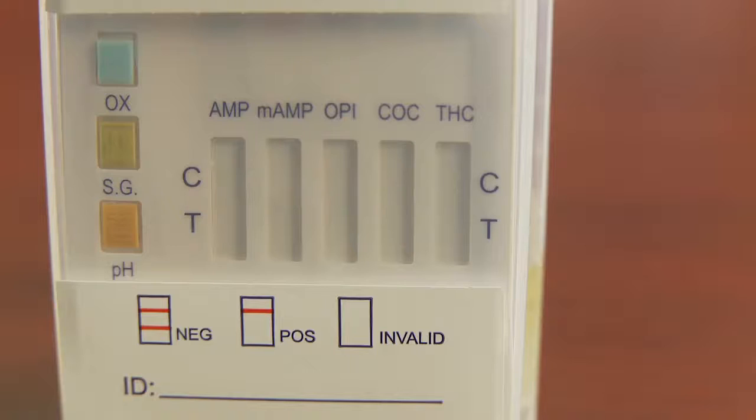Specimen validity may also be determined through a visual inspection. Closely examine the donor's StatCup. Check that the minimum volume has been provided. Also inspect for any odd odors, colors, or appearance of the specimen. If the visual inspection yields abnormal results, stop the testing process and proceed according to your company's policy.